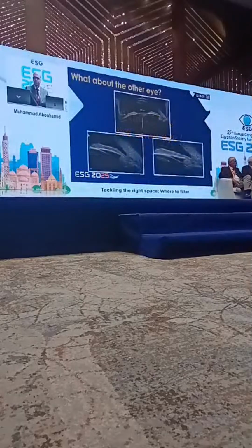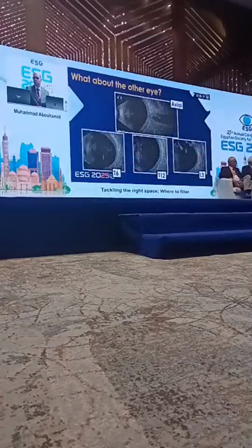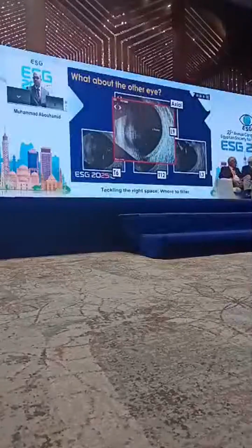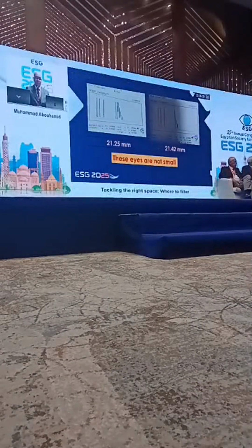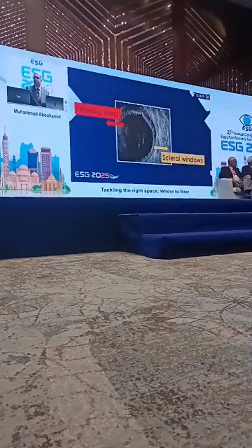What about the other eye? The other eye didn't have such a supraciliary fluid rim, but the choroid was thickened. This thickness cannot be explained only by the macular edema, but unfortunately we couldn't do a proper EDI or swept-source OCT to measure the actual choroidal thickness. But again, these eyes are not small. So what's going on here?